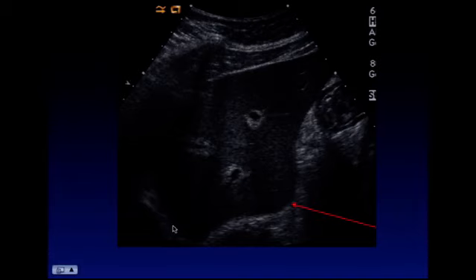However, if we look at the left lobe of the liver, this is a grossly enlarged left lobe, and here is that sort of extra rounding of the inferior edge of the liver that I think can be a very useful sign for knowing when the liver has enlarged.